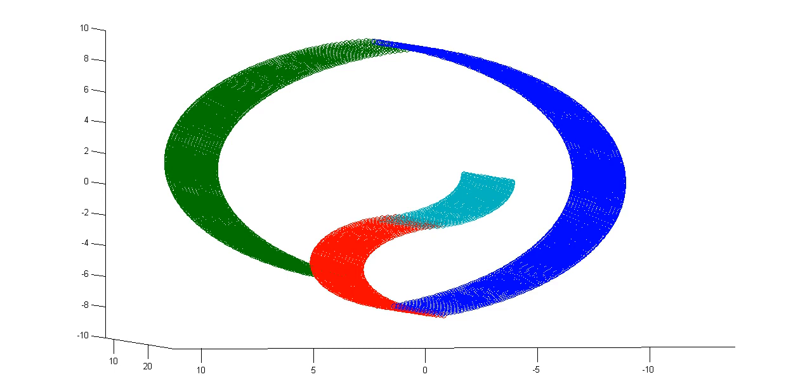And so these kinds of problems, like motion correction and that kind of stuff, a lot of this is handled by pre-processing toolboxes that many labs use. These are software packages that are just part of doing fMRI experiments. They can also do voxel-wise comparisons or any other type of analysis usually. This is generally considered a good thing, that there are standardized methods being used across labs. But there was a paper last year that claimed that I think 3 of the major packages had some errors in them where they were returning false positives at an insanely high rate.